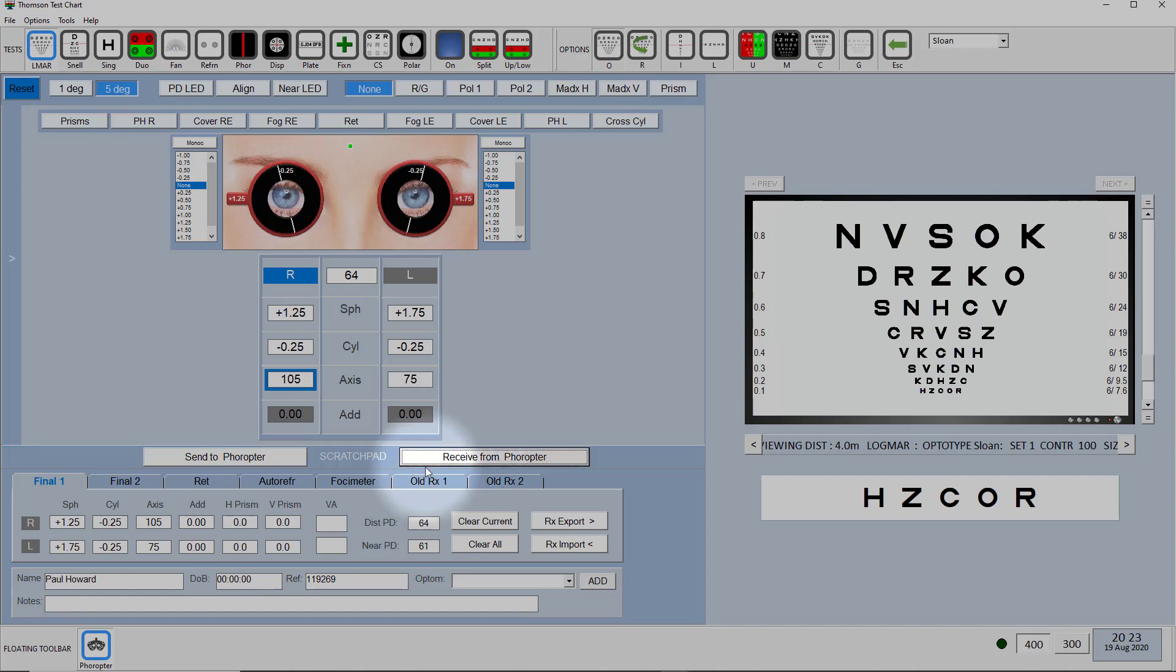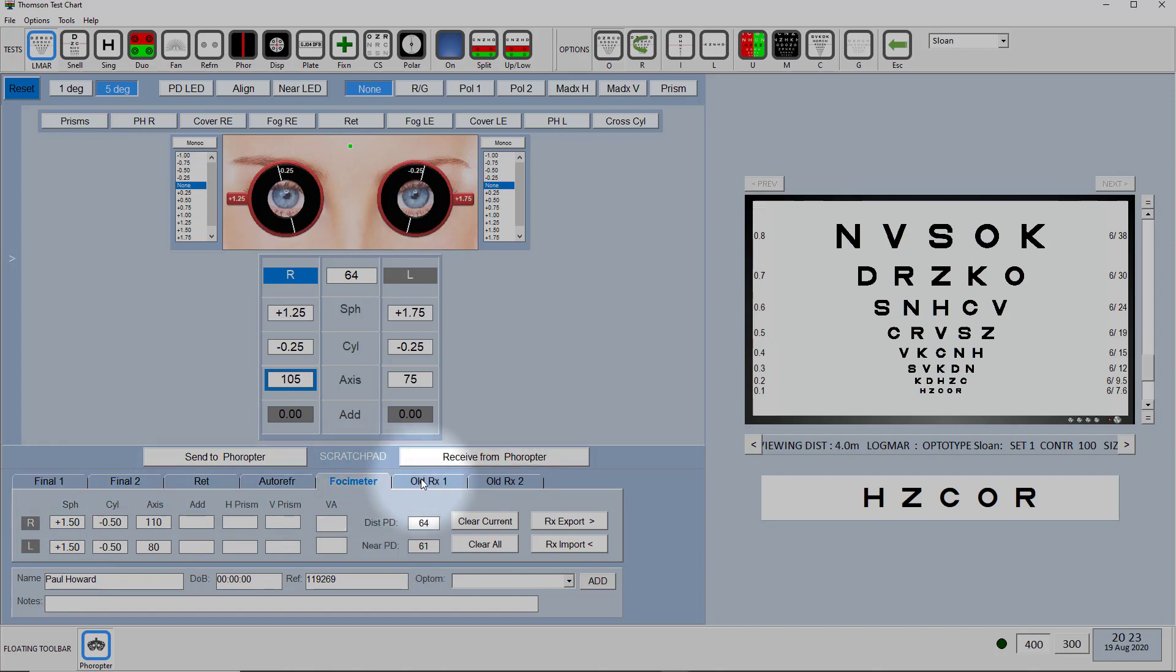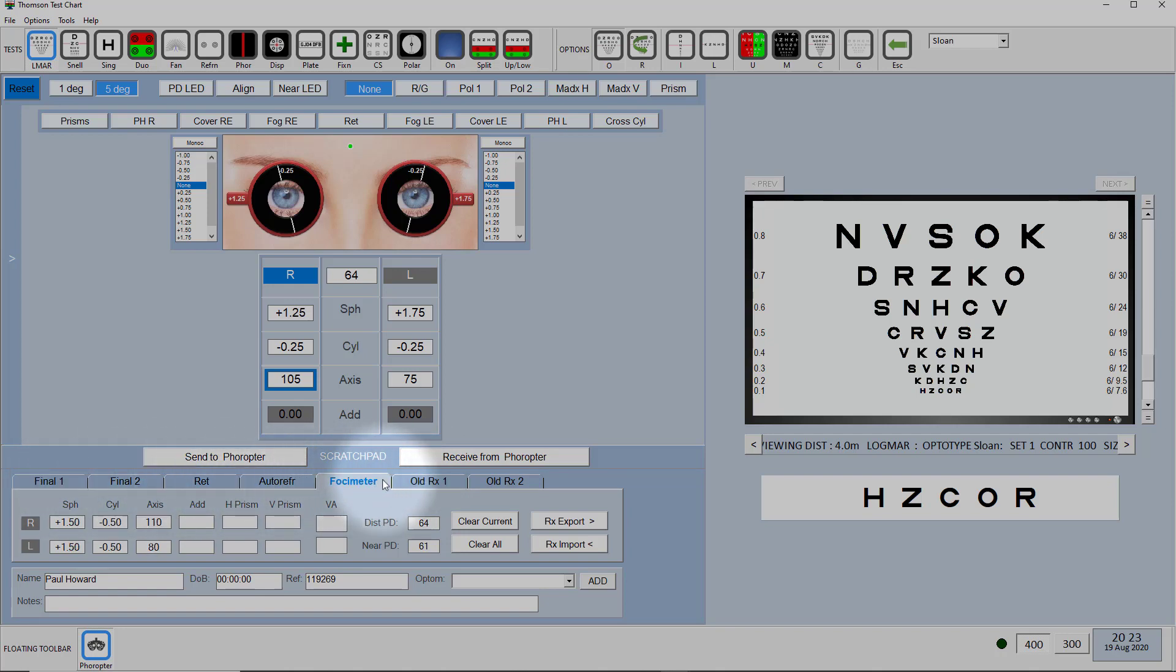So we've now got the final prescription under final one and we've got the old prescription under old RX there, so there's the final prescription and there's the two old RXs.